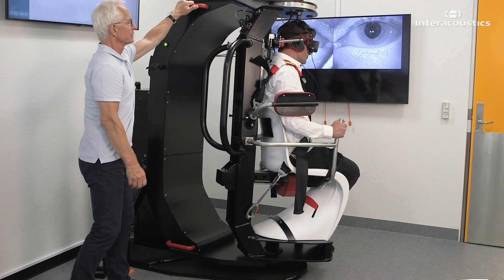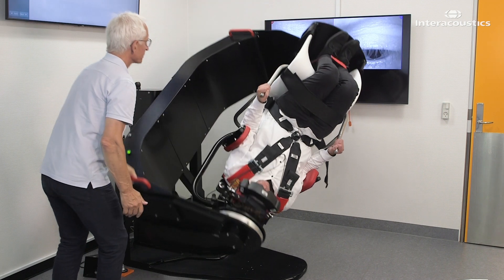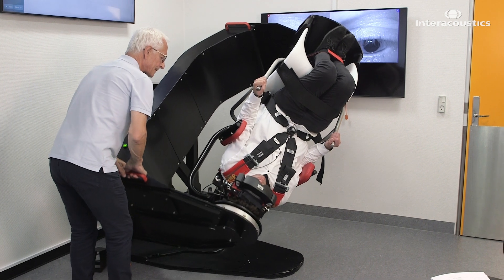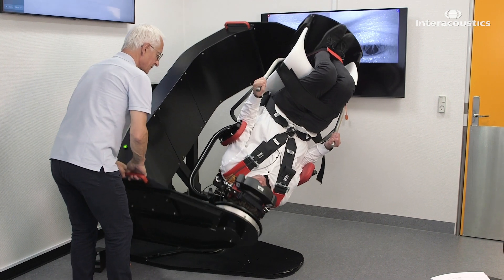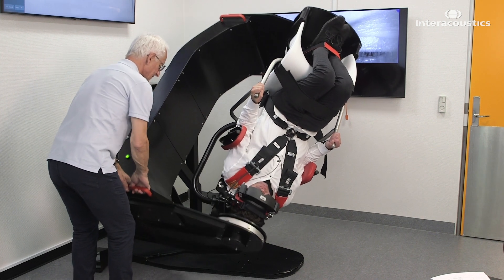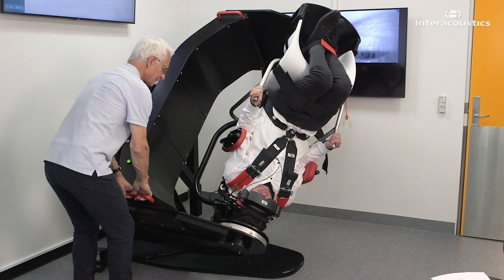Return the patient to the Dix-Hallpike position that came up with a positive test result. Begin the potentiated Epley maneuver by raising the head end of the chair approximately one foot, or 35 centimeters, and bring it back down again against the shock absorber to create a rapid deceleration. Apply 12 rapid decelerations in this position.